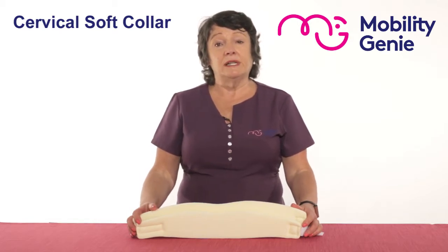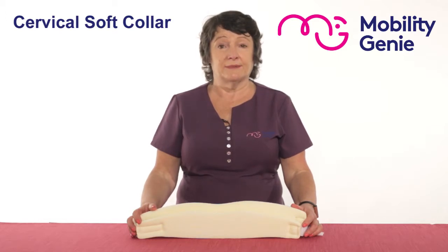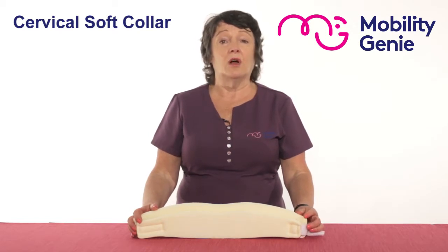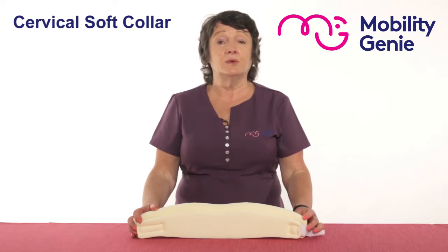At Mobility Genie we do two sizes, two depths: shallow and medium. The shallow is seven centimetres and the medium is nine centimetres. In the shallow size they come in short, medium and long length. The short is 39 centimetres, the medium is 44 centimetres and the long is 48 centimetres. In the deep size the short is 42 centimetres, the medium is 45.5 and the long is 51 centimetres.